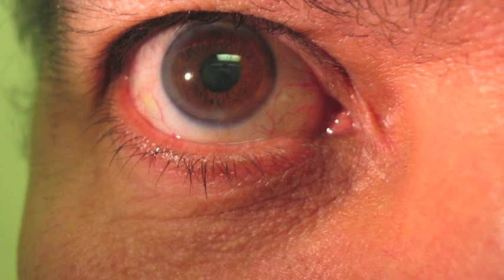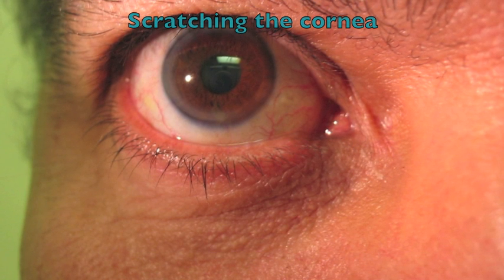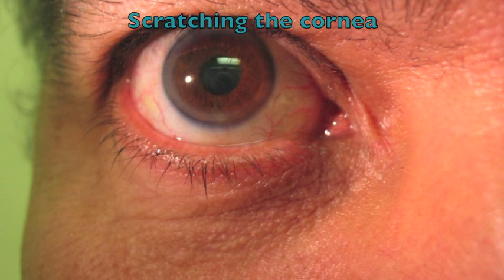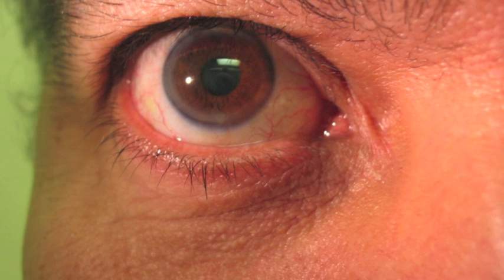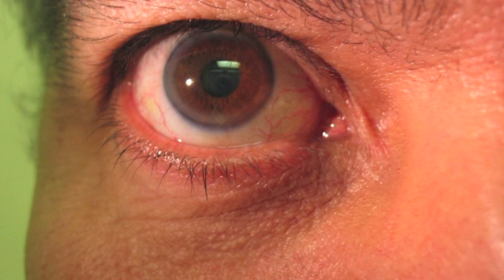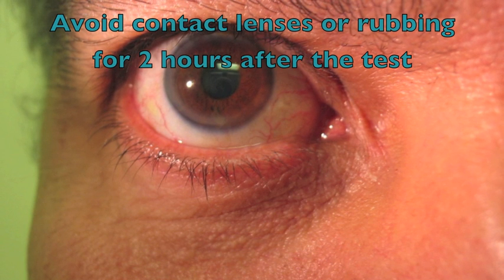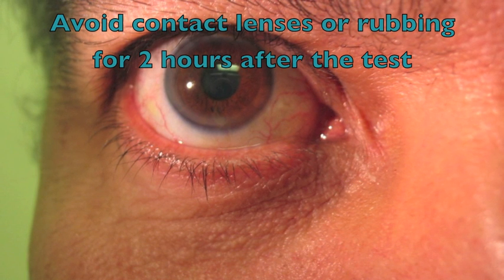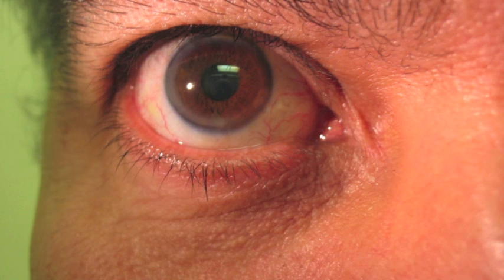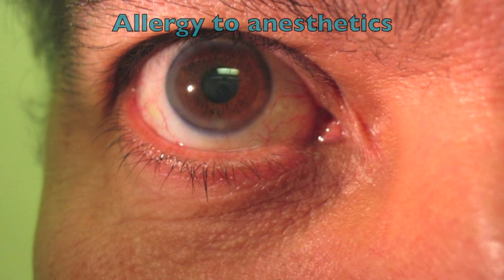If a contact method is used, there is a small chance the cornea may be scratched; if this happens, it will normally heal itself within a few days. To avoid post-procedure complications when using local anesthetic, ask the patient to avoid using contact lenses and to avoid rubbing the eyes for two hours after the test. There is also a very small possibility of having an allergic reaction to the anesthetic agent.